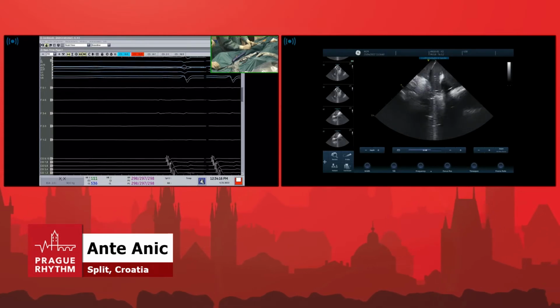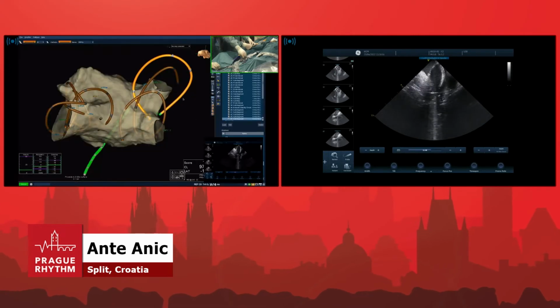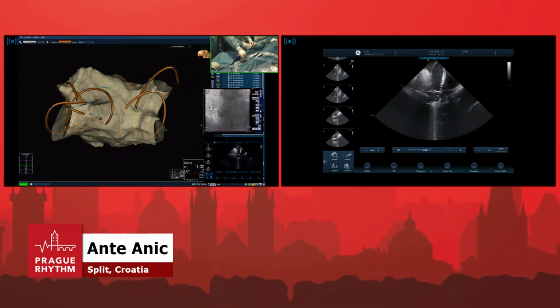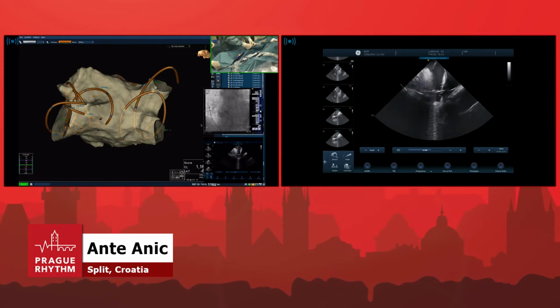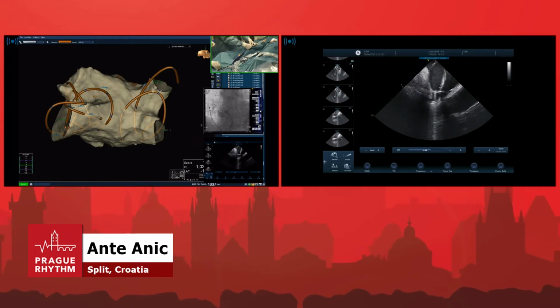Now I'm coming down, rotate, because I want to hit the carina like this. So we are doing the segmental part. Go. RSPV, you see? We are now touching the lower part. RSPV, pulse 3. So we're going to do 8 applications in the flower, and it's like a segmental approach, like you're doing with the cryoballoon, with the trunk, whatever. Because sometimes when it's too big, you better do it segmentally. RSPV, pulse 4.